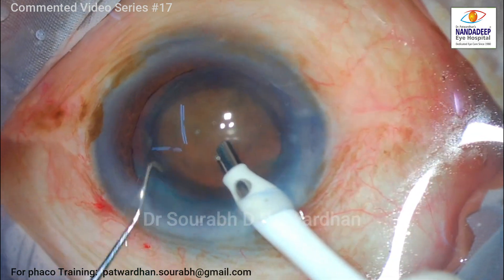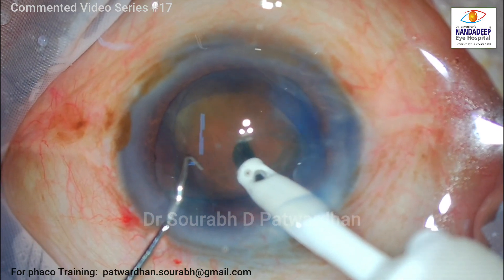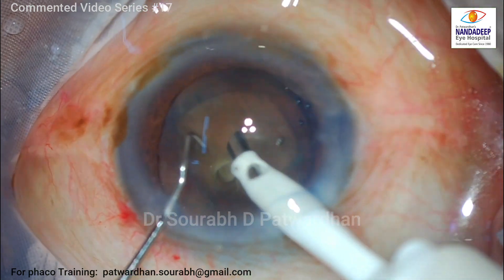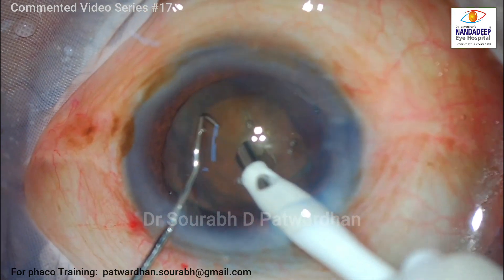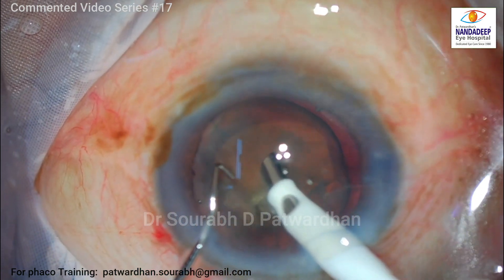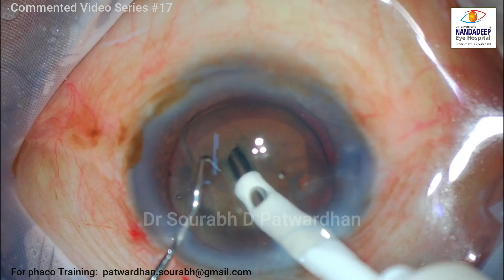Don't try to go for very large excursions to start with. The phaco tip here is a Kelman tip which comes with the machine, and in my left hand I am holding Patvardhan's hybrid chopper, which is very good for doing horizontal chops — I will show you how I use it. I am just struggling with the phaco here because I don't know what power has to be set, so I have the technician helping me and I am asking him to slowly increase the power as I make a small groove to take hold of the nucleus for burying the tip.